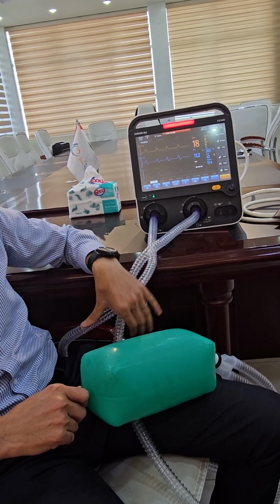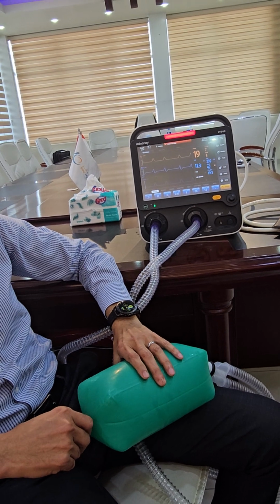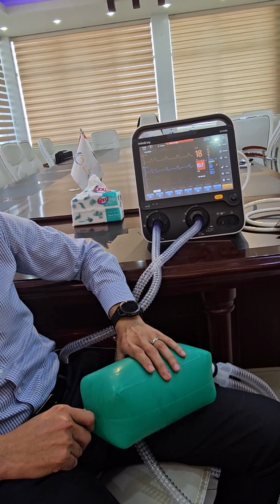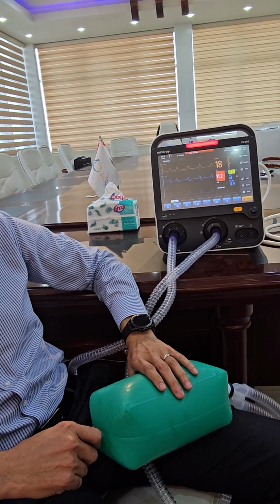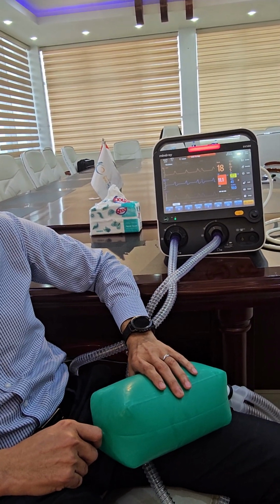Do you have a fault in the tubing? Do you have a problem in the patient? Do you get pulmonary edema? Do you have pneumothorax? Do you have obstruction? Do you have secretion? Is the patient fighting the ventilator? Do you need a surfactant? Do you need a bronchodilator? What exactly is happening to the patient?